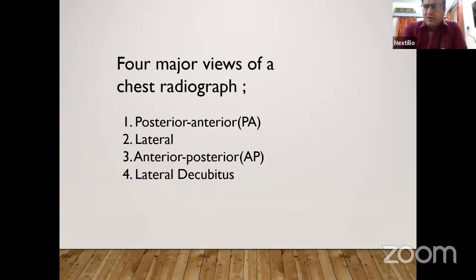Commonly what we see in our general practice is the PA view, posterior anterior view. What does posterior anterior mean? It means the X-rays are entering posteriorly, exiting anteriorly, and the film is on the anterior side of the body. Posterior to anterior, they are entering. Same for lateral, we can see what is happening.